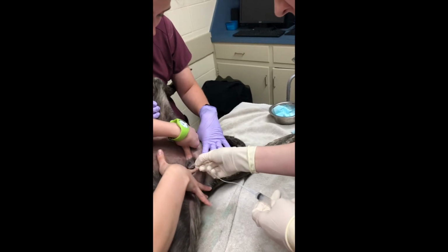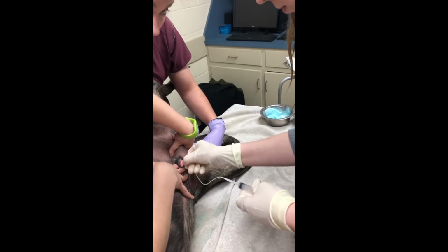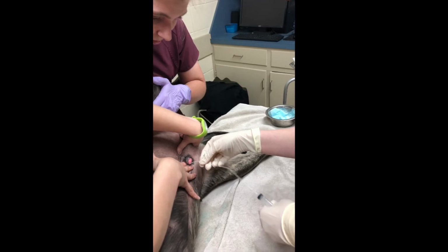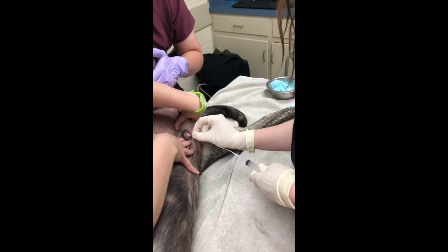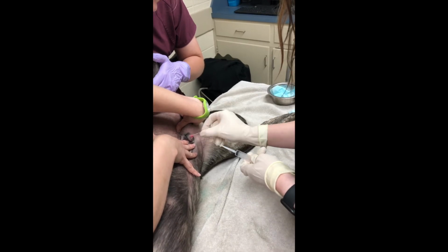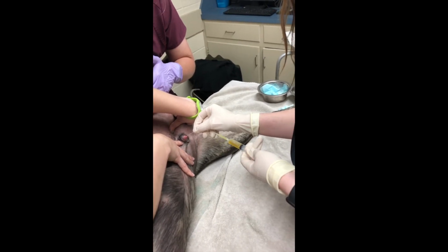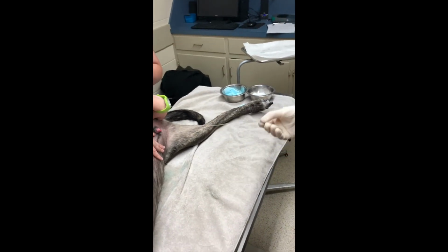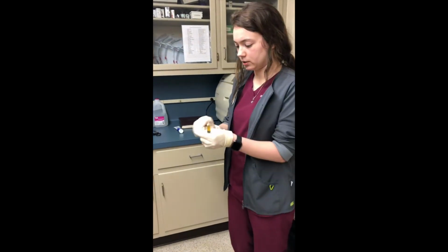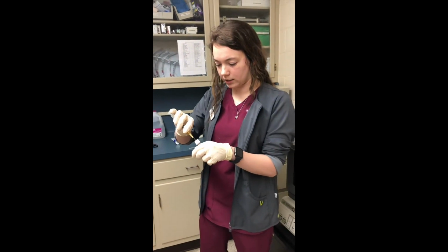He's trying to get it back in. And then I'm going to put a sterile syringe on it. And stick it directly into a white top tube.